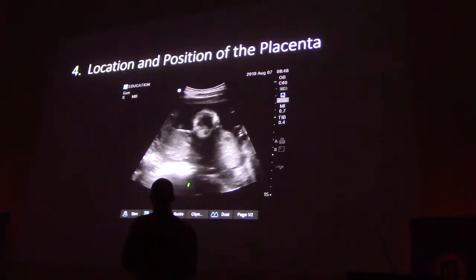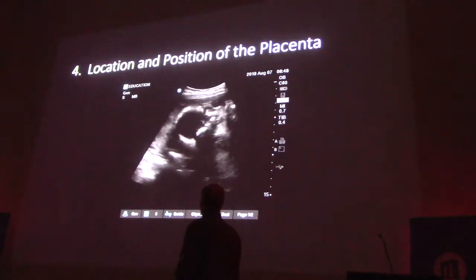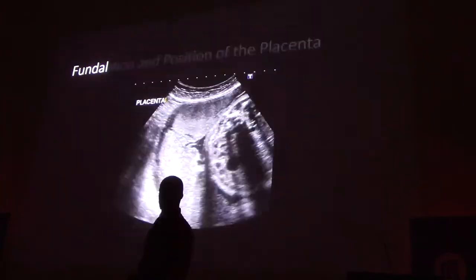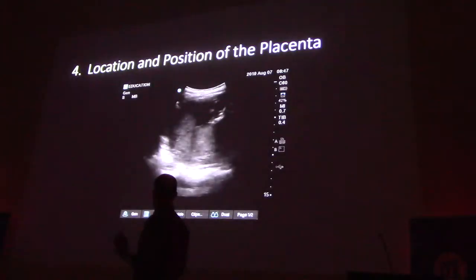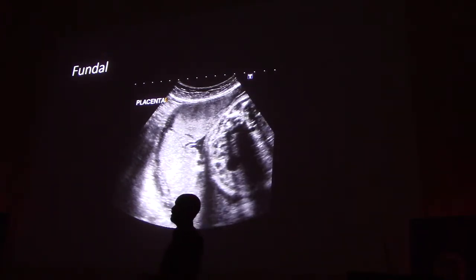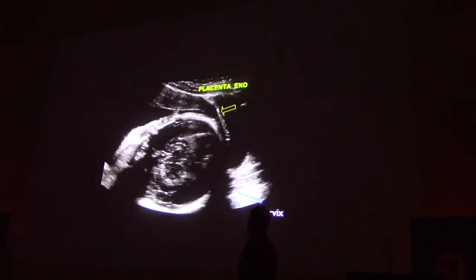Second patient, similar fundal presentation of the placenta. This is the patient with the breech presentation. So fundal and posterior. So I don't have a lot of saved images of pathology, so I can go to Google, which is fun. So in general, this is our fundal. This is just screenshots of a fundal placenta. An anterior one, normal again. This is an anterior one that kind of comes down pretty close to the pubic symphysis.